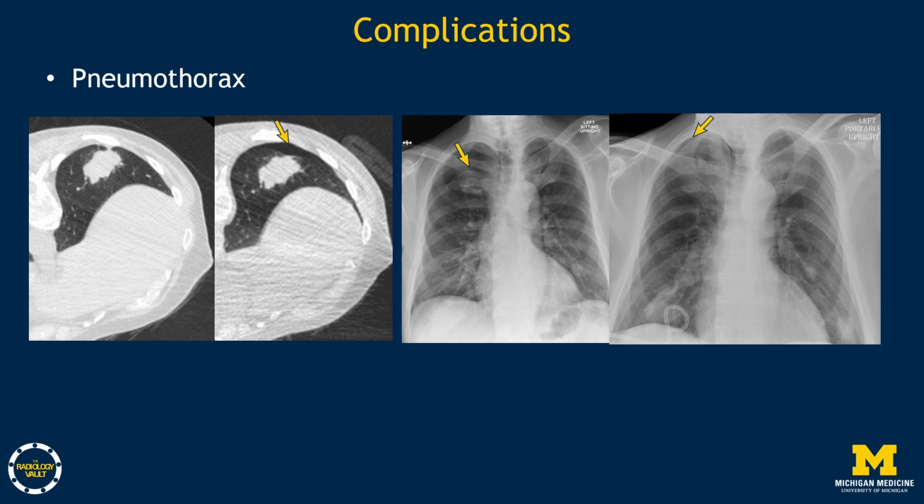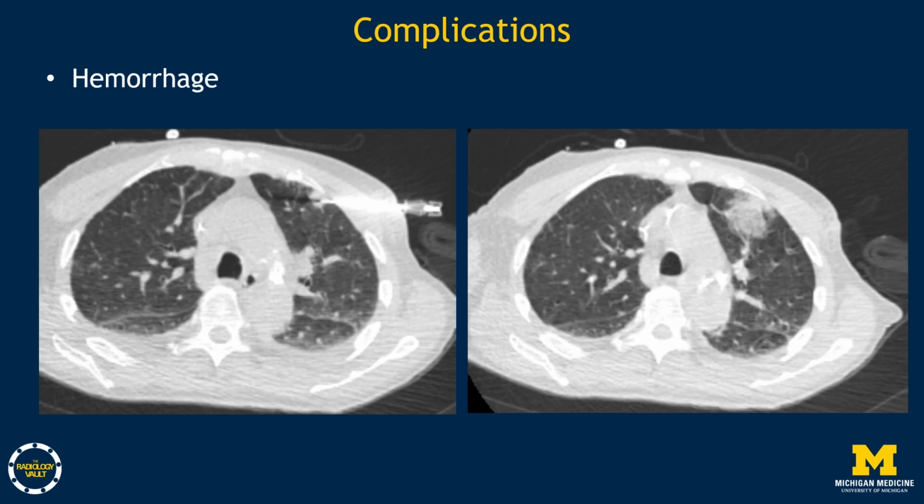In this example, a subpleural nodule in the anterior left upper lobe was biopsied via a lateral approach as the patient could only tolerate a supine position. During tissue sampling, there was blood returned via the introducer needle and the patient experienced coughing and mild hemoptysis. Post-procedure imaging confirmed the presence of perinodular ground glass consistent with hemorrhage. This patient was asymptomatic following the procedure, and an ill-defined opacity on chest X-ray resolved within 2 hours. Pathology confirmed lymphocytes in this patient with history of B-cell lymphoma.